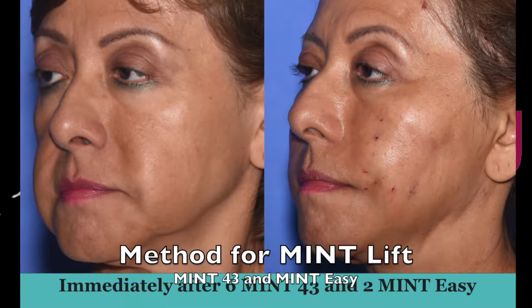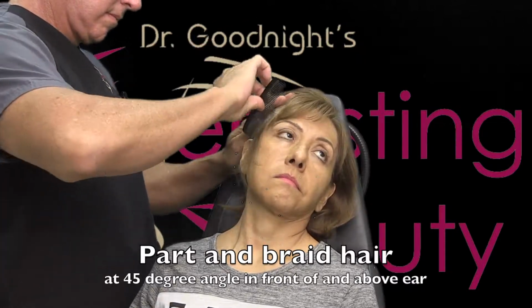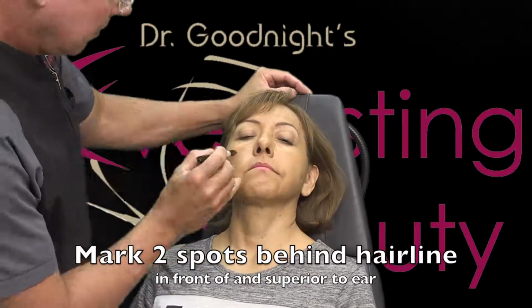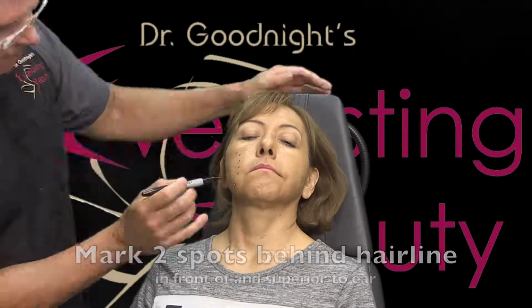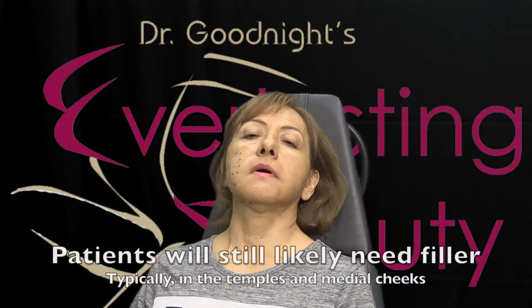This shows how the Mint 43s with the Mint EZ's procedure is performed. First, you'll need to part and braid the hair, preferably at a 45-degree angle above the ear and in front of it. And then you mark the 2 spots where you're going to enter, and then 3 spots lateral to the nasolabial folds, and 3 above the jowls where you're going to exit with the thread.